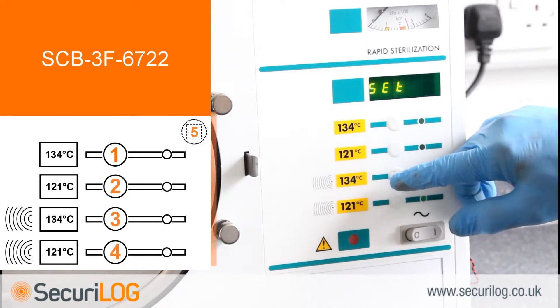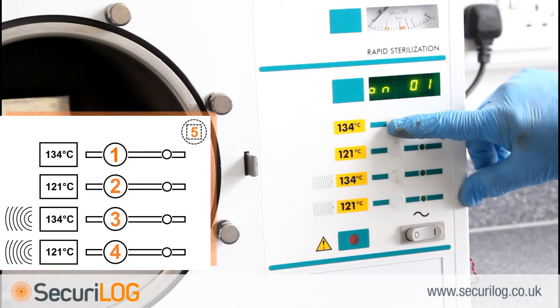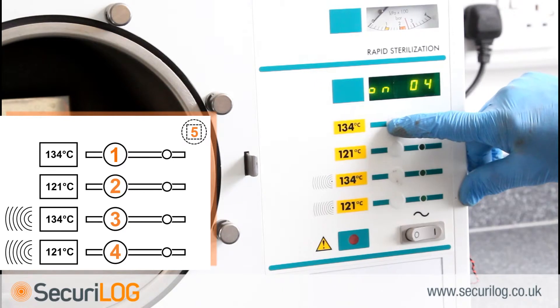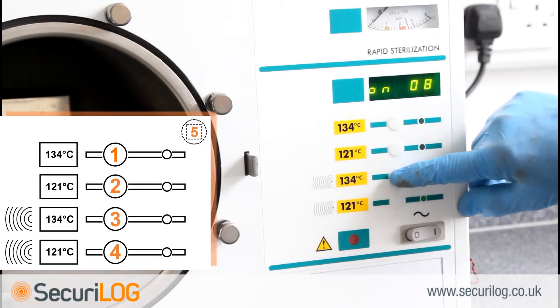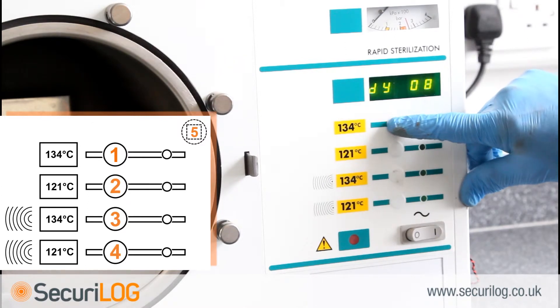Next, the date and time need setting. The month is made up of two numbers — January is 01 through to December 12. With the display reading ON01, press button 1 to begin selecting the required number; button 1 increases, button 2 decreases. When the display corresponds with the required month, press button 3 to select. The display will now read 'DY01'. The day is made up of two numbers, 01 through to 31. Use buttons 1 and 2 to select, then press button 3 when the required day is displayed.